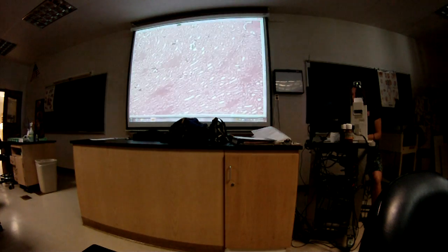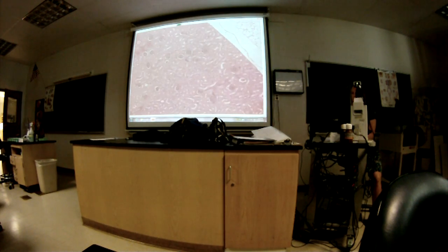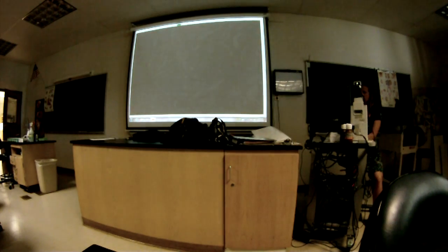All right, so go back to the scanning lens, get a little bigger picture view. And it looks like that. What region? There's more of it that we're not seeing, but what is this general region of this organ called? Okay, we're just writing our answers down, so get out a piece of scratch paper if you're just joining. And let's go back over here. Okay, get a little closer.